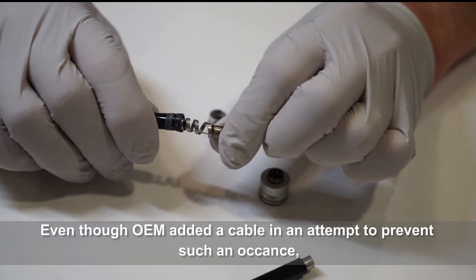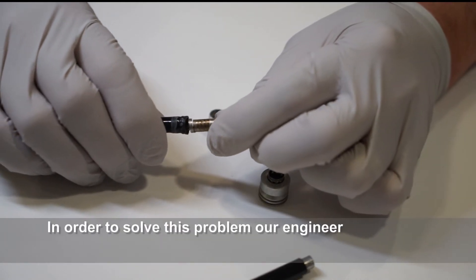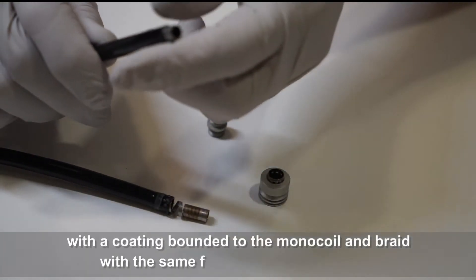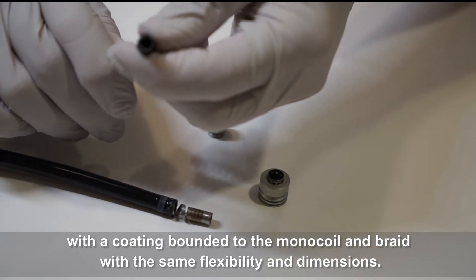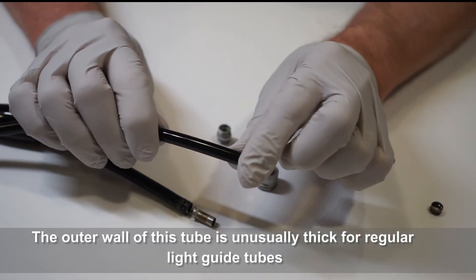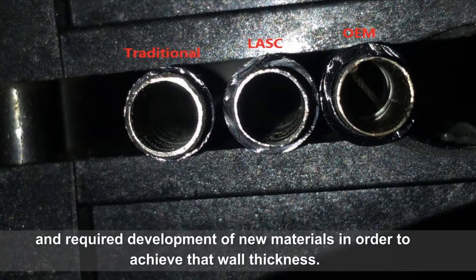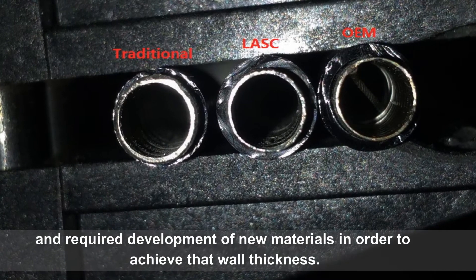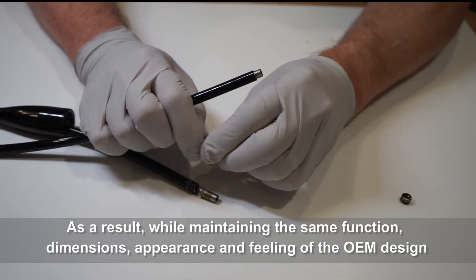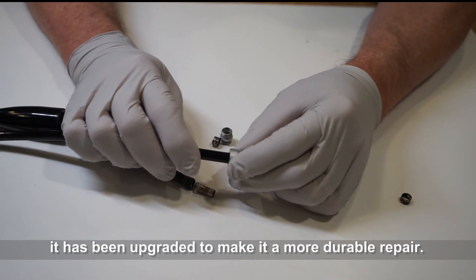Even though the OEM added a cable in an attempt to prevent such an occurrence, it could only maintain the total length of the tube. In order to solve this problem, our engineers developed a new type of tube with a coating bonded to the monocoil and braid, with the same flexibility and dimensions. The outer wall of this tube is unusually thick for regular light guide tubes and required the development of new materials to achieve that wall thickness. As a result, while maintaining the same function, dimensions, appearance, and feeling of the OEM design, it has been upgraded to make it a more durable repair.